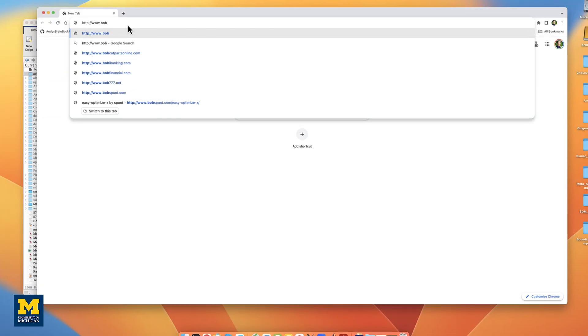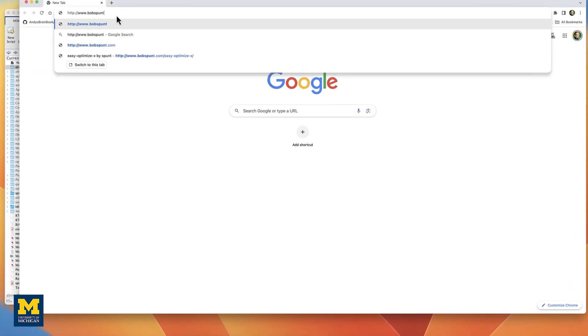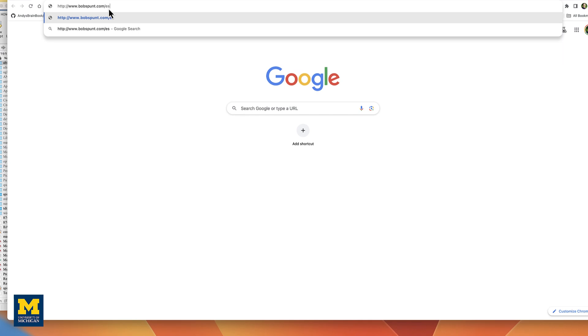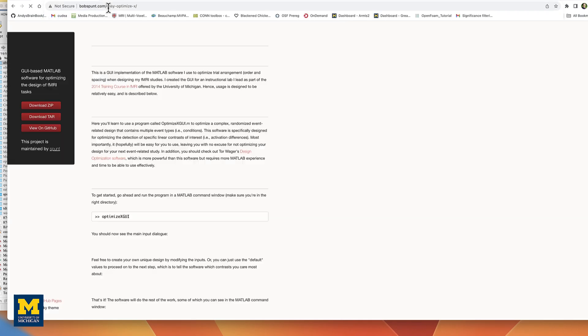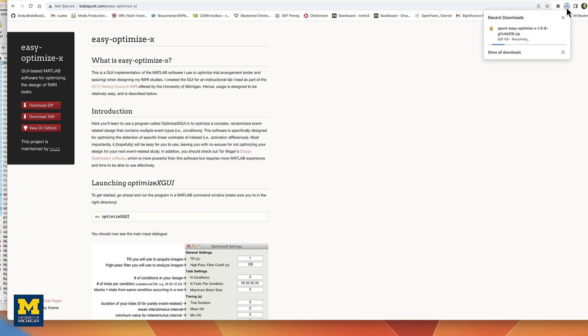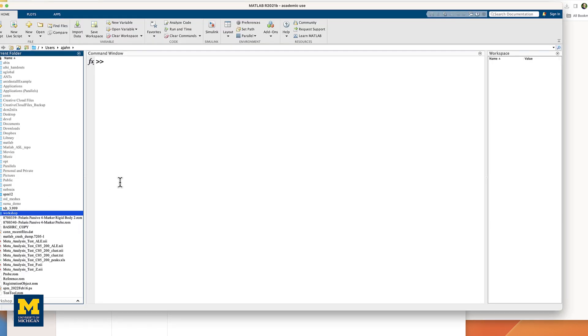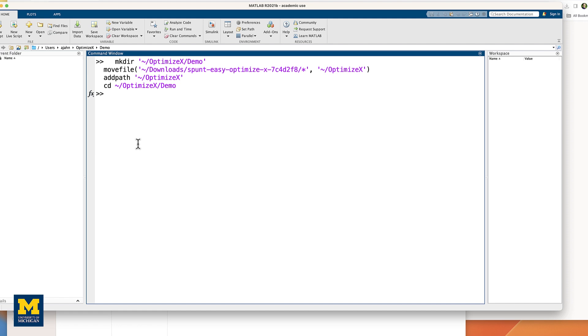To get started, go to www.bobspunt.com slash EasyOptimizeX, and then click on Download Zip from the menu bar on the left. When it has finished downloading, unzip the package, and then move it to your home directory and add it to your MATLAB path by opening a MATLAB terminal and typing these commands. You can find them in the more info box down below.